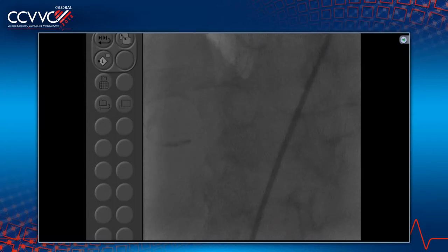Okay, now you get us a 3.0/30 balloon, right? That's what you want us to use, George, a 3.0/30 balloon for the distal RCA? I'll probably go to 2.75/30. It's a little bit too big, I think. Let's not go 3.0 yet. You just were at 2.0, I think. So don't jump from 2 to 3. Anyhow, we probably want to use a 3.0 stent.